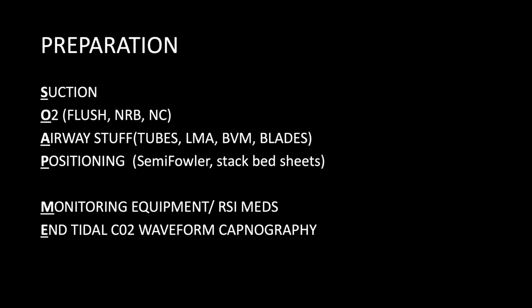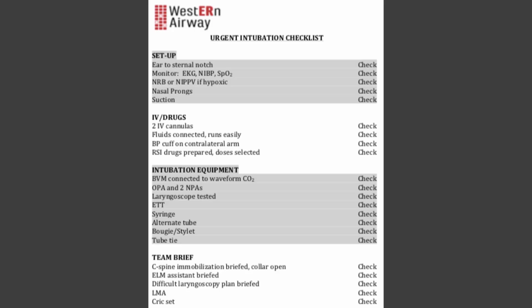I'm not a big fan of mnemonics, but one here that is commonly taught is called SOAPME: suction, oxygen, airway stuff and equipment, making sure your patient is positioned in an appropriate manner if possible, monitoring equipment and your medications, and then lastly, end tidal capnography to confirm placement.